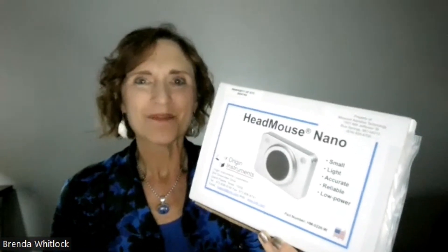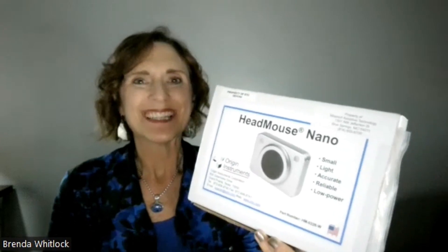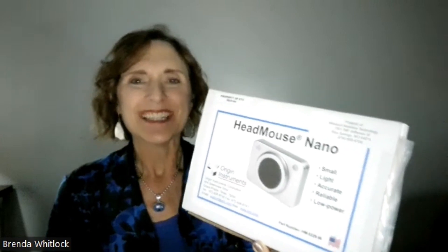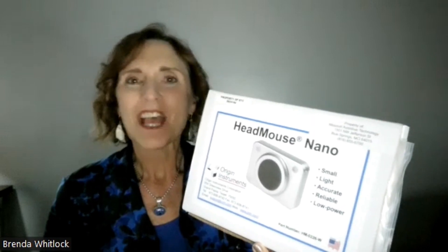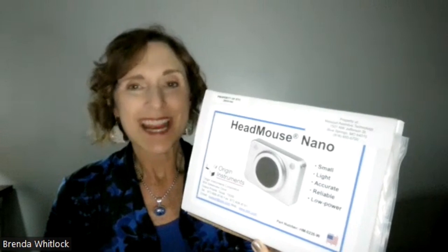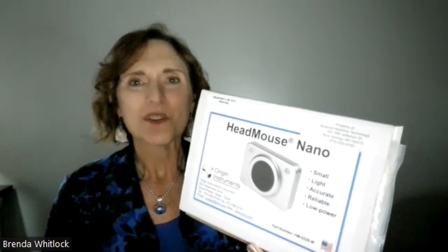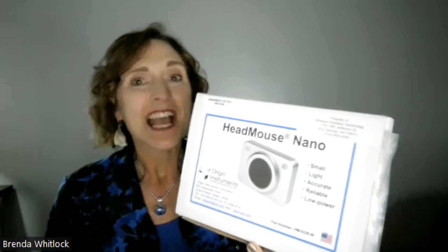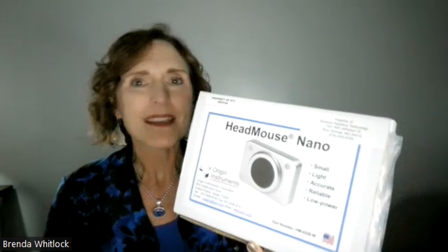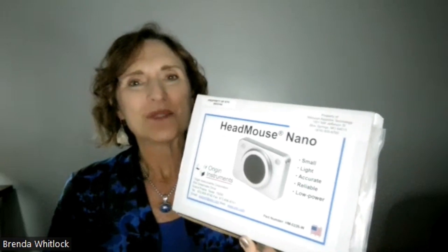Hi, this is Brenda Whitlock with Missouri Assistive Technology. We're doing the Let's Talk ICT AT Toolkit for Web Accessibility Testing, and today we're going to unbox the Head Mouse Nano and show you how to set it up — it's really easy. It is plug and play. We'll show you what comes out of the box and then connect it to a Windows device. It will also connect to a Mac computer or a smart device that uses a USB for the mouse function. So let's get to unboxing.